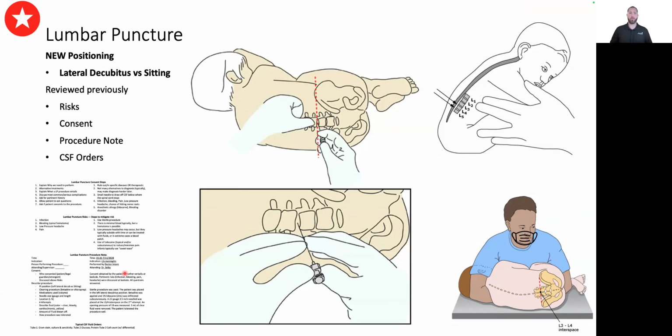When performing a lumbar puncture in a pediatric patient, there's a few differences from adults. You can still set up in generally the same way, but you also need some skilled helpers who can hold your patient still while you're performing this. Another benefit for pediatric patients is that their anatomy is so much smaller, so usually you can feel the landmarks quite well on the spinous processes. You're still going to be going between that L3, L4 mark, finding that patient's iliac crest and dropping down.